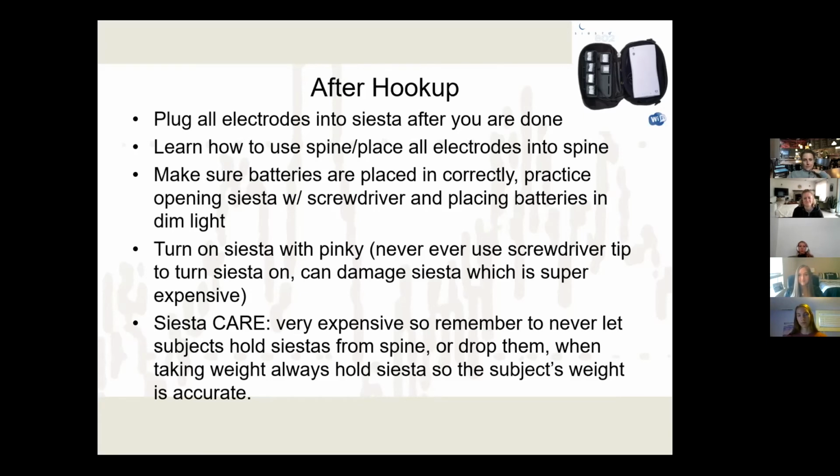And so yes, these are now the most expensive pieces of equipment in the lab. They're approximately $30,000 each. So these need to be very, very well cared for and treated like the precious little babies that they are. And they're kind of light purple. They're very pretty, which I didn't even know. Apparently that's the original color of the ones that we're used to, but they got so discolored over the years. So yes, we want to take really good care of these devices.